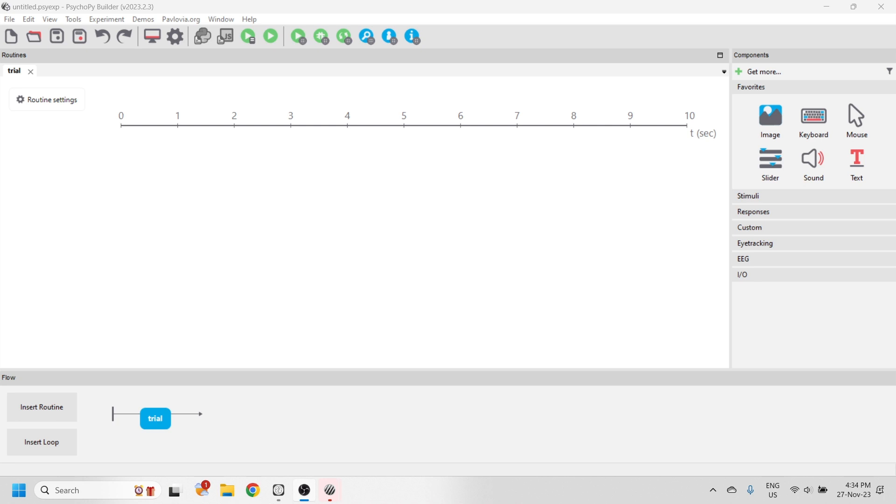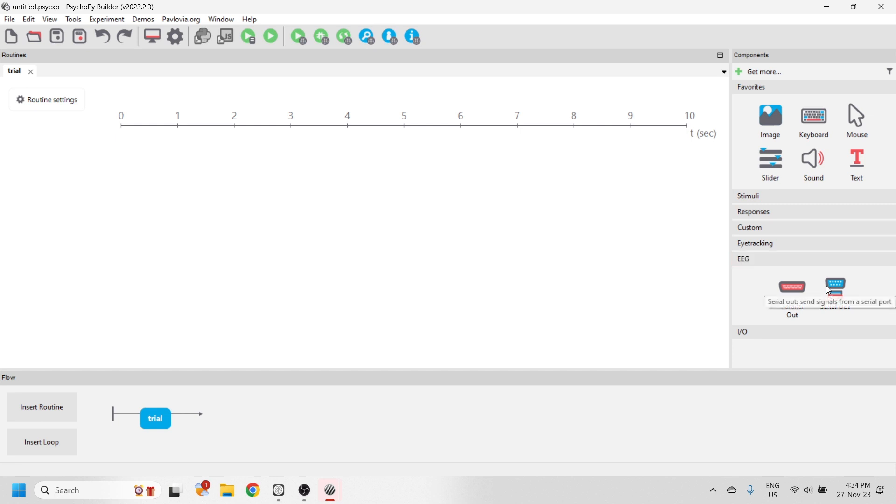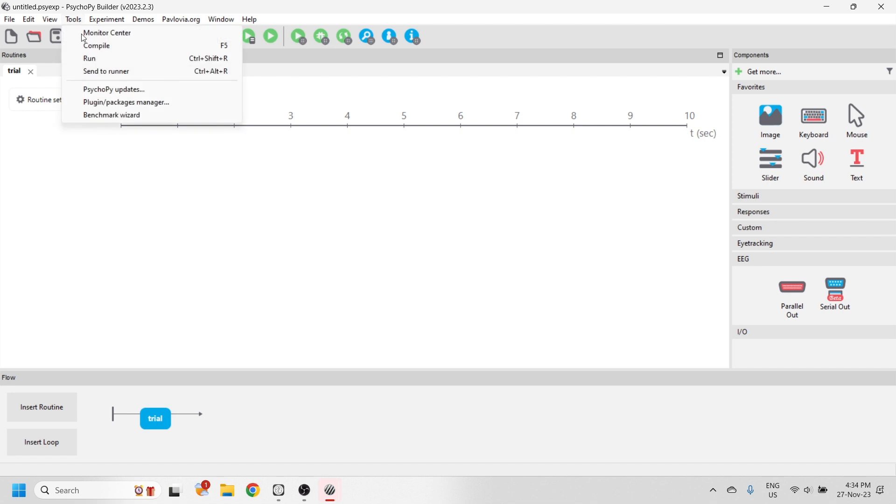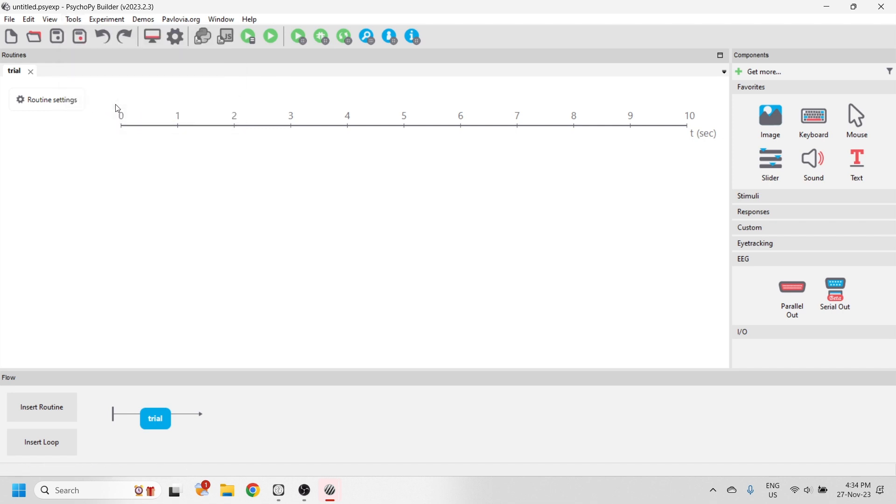Now let's add the Emotive plugin to PsychoPy. When you first open PsychoPy, you'll find that you don't have any of the Emotive components under the EEG section. Go to Tools, select the Plugins Package Manager.